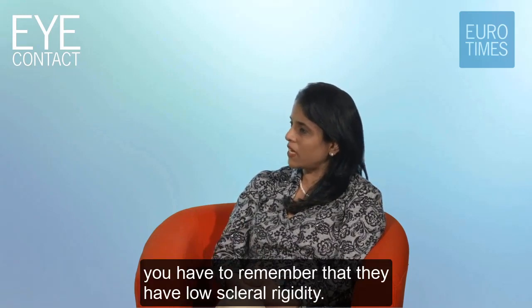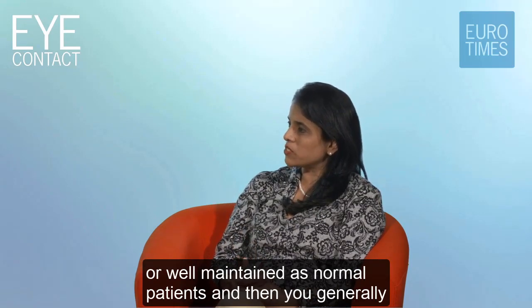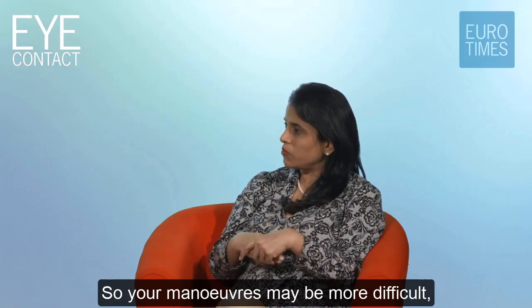You have to remember that they have low scleral rigidity, so their corneal tunnels may not be as well constructed or well maintained as normal patients, and then you generally also, because these eyes are larger, you do end up working a little bit more vertically, so your maneuvers may be more difficult.